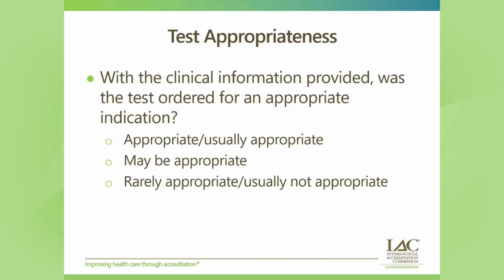So the question that first pops up in the QI tool is, with the clinical information provided, was the test ordered for an appropriate indication? While the evaluation of test appropriateness is not a requirement for IAC pediatric echo accreditation, it is always important to evaluate. Therefore, we opted to include this in the QI tool assessment as well.